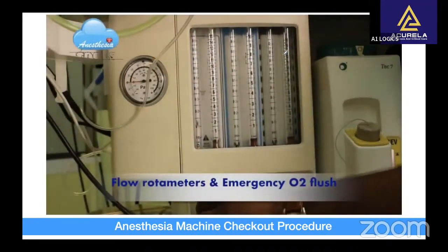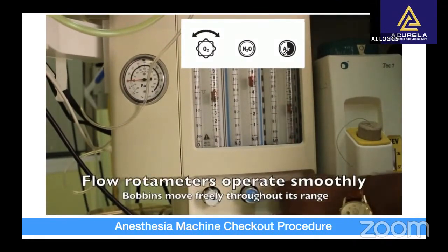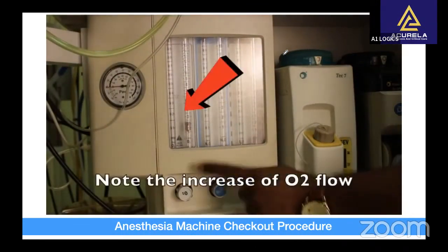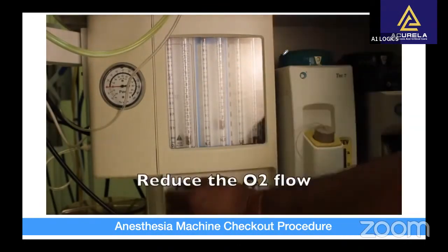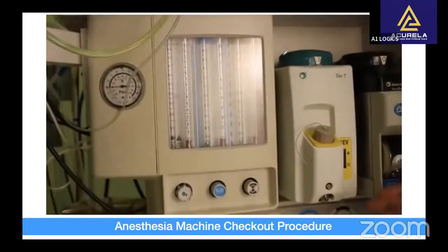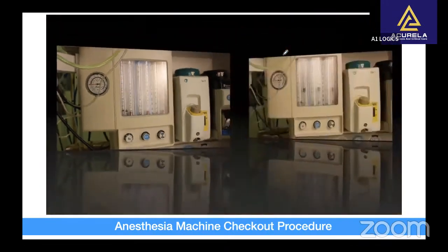Check that flow rotameters operate smoothly and bobbins move freely throughout its range. Now checking for anti-hypoxia safety features. Increase the nitrous oxide flow. Note that oxygen flow meter automatically turns on. Now reduce the oxygen flow up to 0. Note that nitrous oxide also automatically comes down to 0. See that the machine shows FiO2 more than 21% throughout the full range.